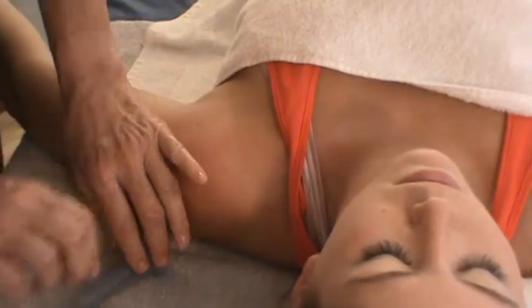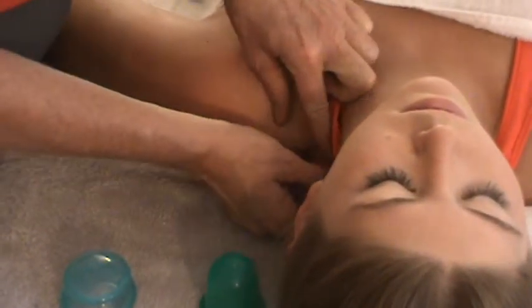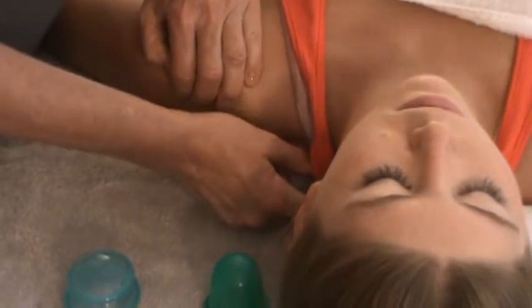Now upper trap, you might want to get a bigger cup or a little bit more of a grippy cup. So I'm using a larger silicone cup. Silicone cups are also greatly beneficial because they're so flexible and pliable. Find that trigger point in the upper traps, and you can start to open up that area as well.